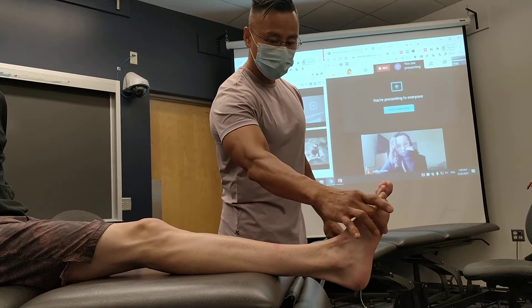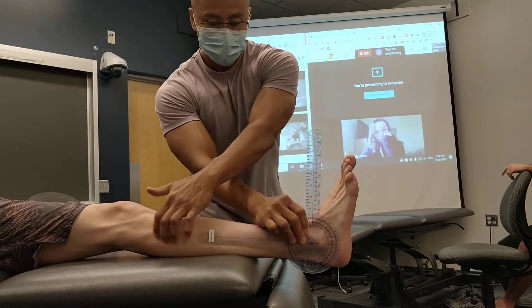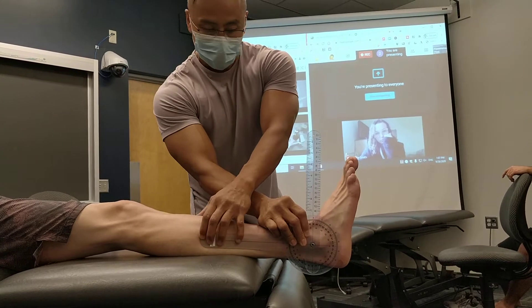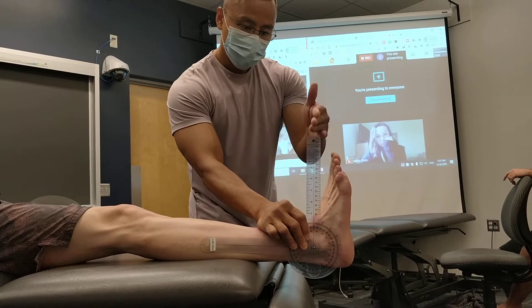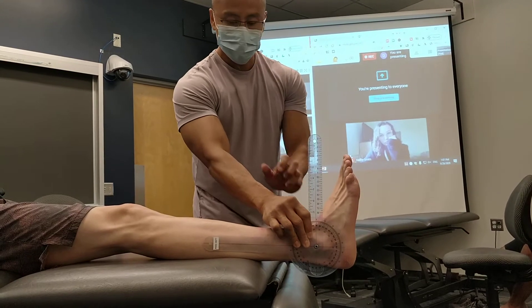So let's just start normally first. He's at 90 because this is at 90, and I'm eyeballing. This is parallel. This is perpendicular. So the plantar surface or shaft of the fifth is perpendicular to the tibia and fibula.